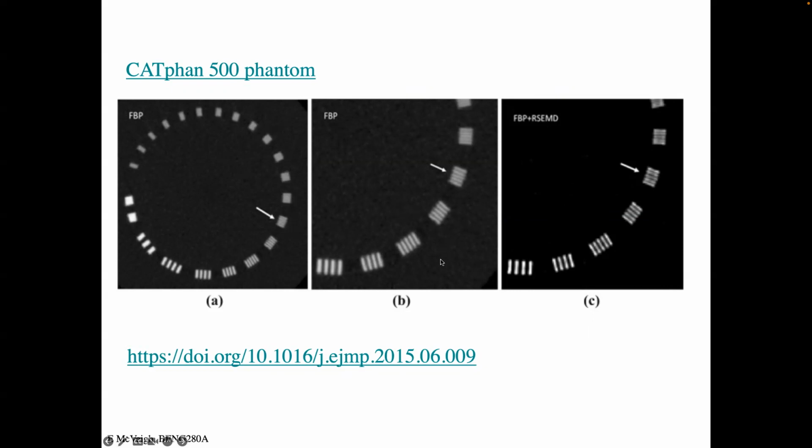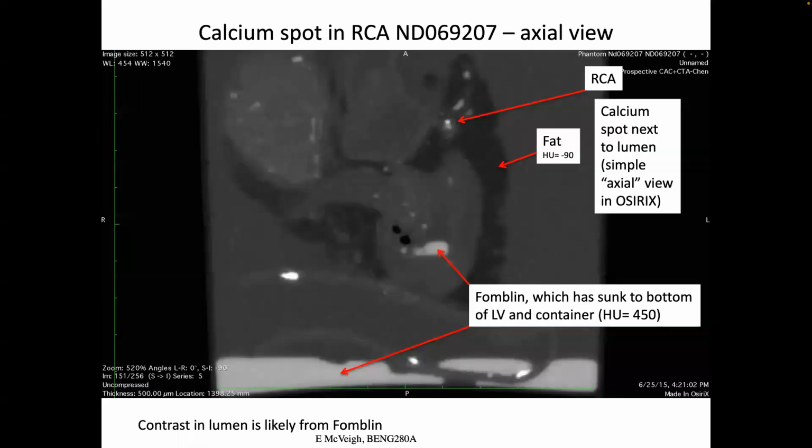And this is just pulled out of a paper where these folks claim that with their filtered back projection or convolution back projection, plus their new twist to that, they can get basically higher resolution, judging by the contrast here versus here. So that's what they were doing here. And so these phantoms are available, and in most CT clinics, you have these and you just measure the image.